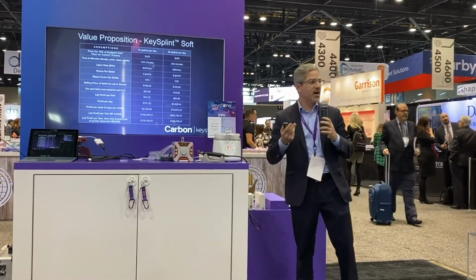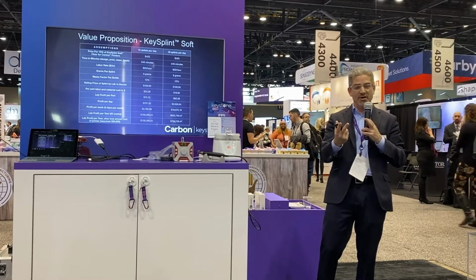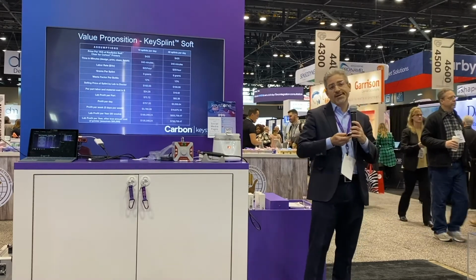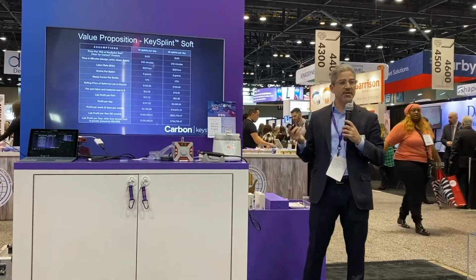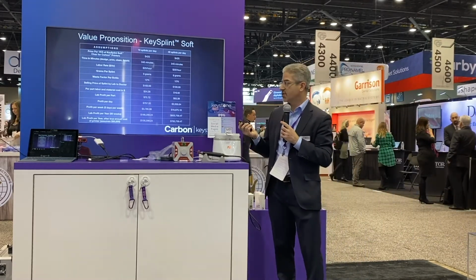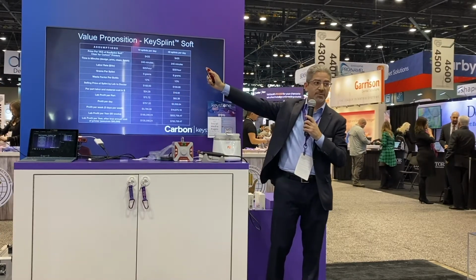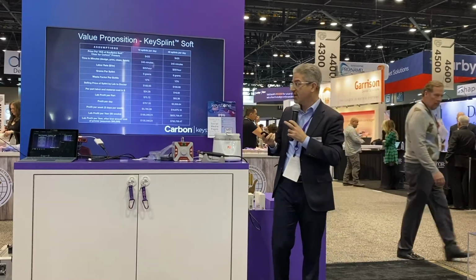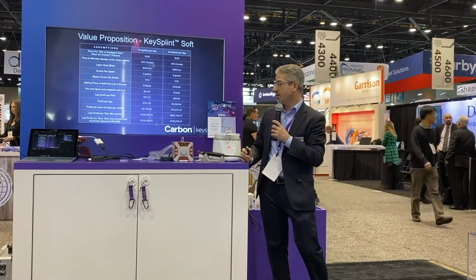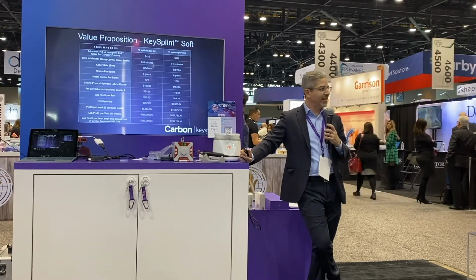A waste factor per bottle, somewhere between 12 or 15%, between supports and residual goo that's on the part. Let's assume you're selling from the lab to the doctor at $100. I think that might be low, but let's assume it for here. Your fully loaded labor and material cost at 10 splints per day is 24 bucks per splint. If you're increasing your volume up to 40 splints a day, you have labor savings. So you're down to about $16 to $17 per part. That yields a profit to you of somewhere between $75 and $83 per part if you're selling at $100 per lab. So on the next slide, I call it 80, okay?